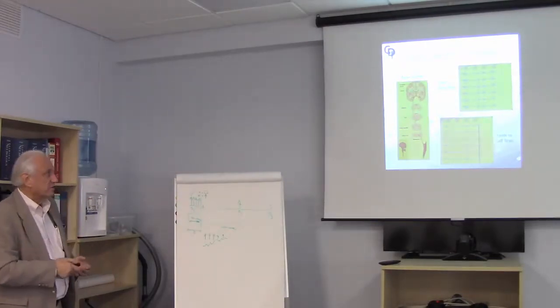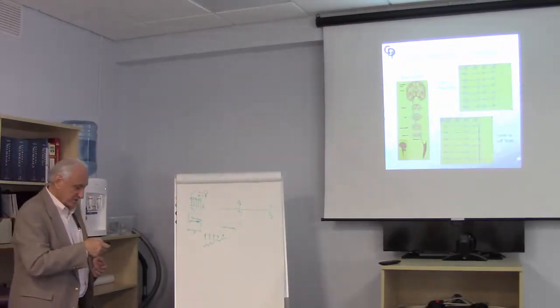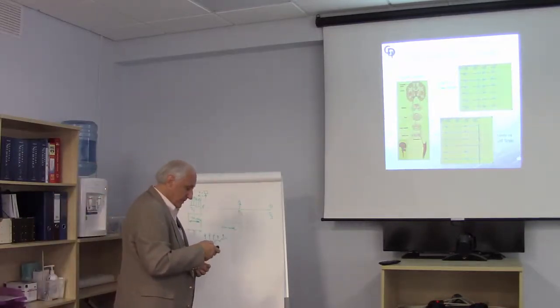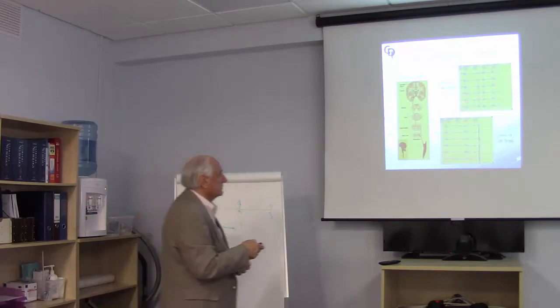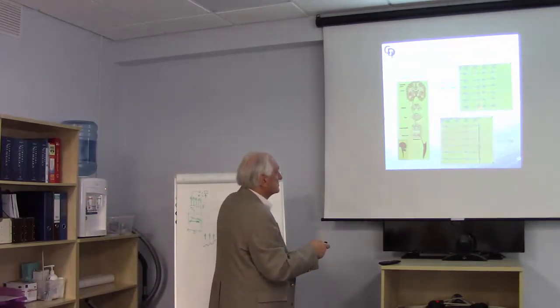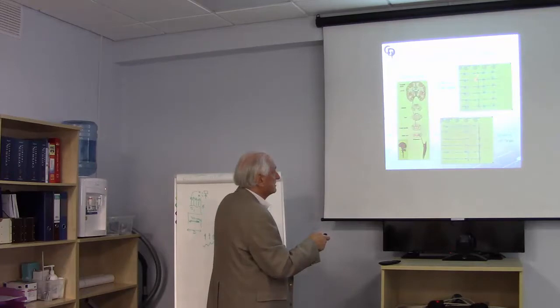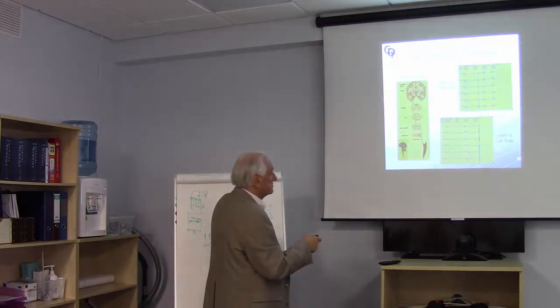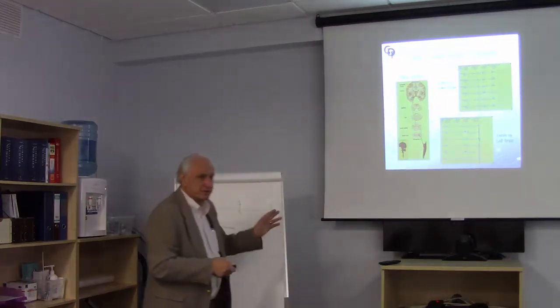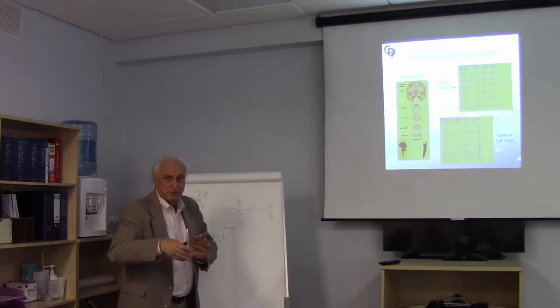So just a quick review. This slide makes the point about the anodal stimulation. Here we have the muscle groups on the left side. In this case, we have one muscle group from the upper extremity, one from the lower extremity. This is the right side muscle groups, and you can see in this case the anode was on the right brain, so the anode was at C4.